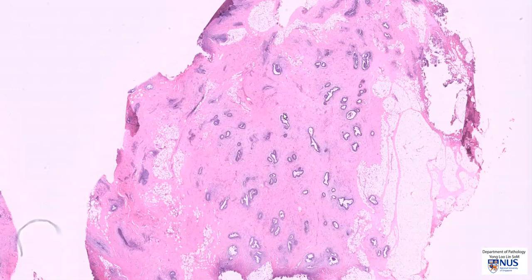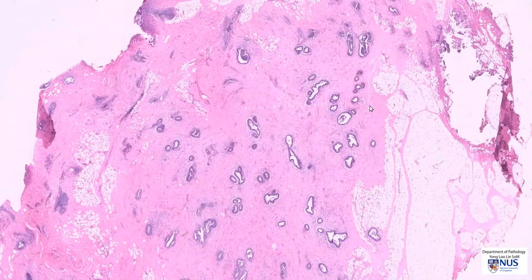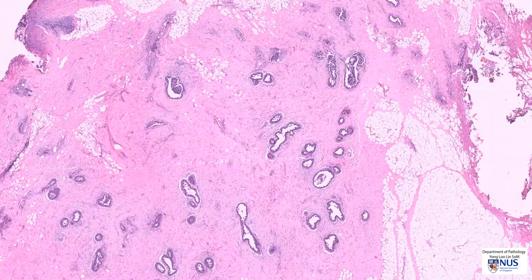The stromal elements are composed of pink collagen tissue, as well as some adipose tissue. The key feature of gynecomastia on histology is the presence of an increased number of ducts, but without accompanying lobules.